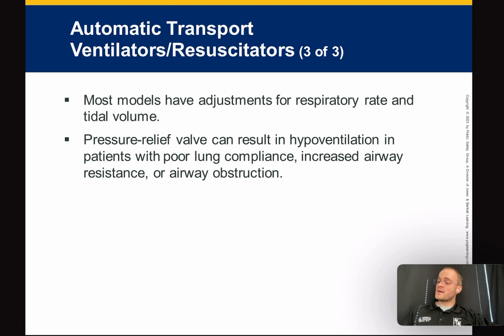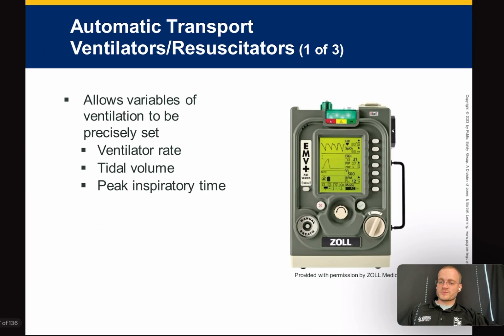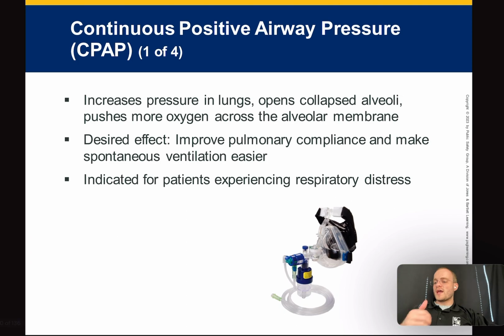And so the nice thing about an automatic ventilator like this one, this is a Zoll, right, is you can fine tune a lot of things. How much pressure do you want to use? How fast do you want to deliver the breath? What's the rate that you want to set? What's the PEEP, or the CPAP, or all these different settings you can set to clinically improve your patient. And where paramedics get in trouble is there's almost too many options, or they don't know what all the options do. So just be aware, right?